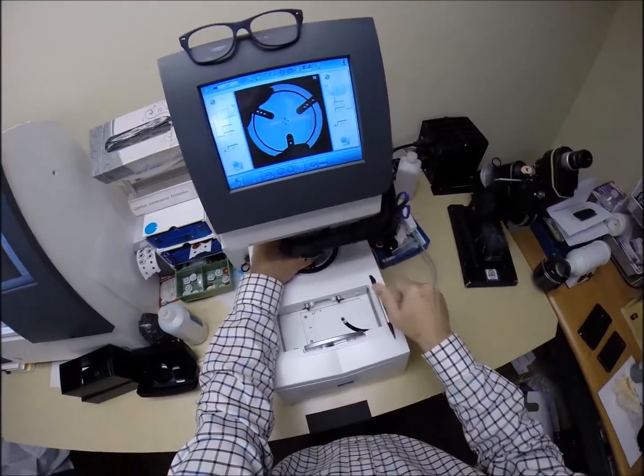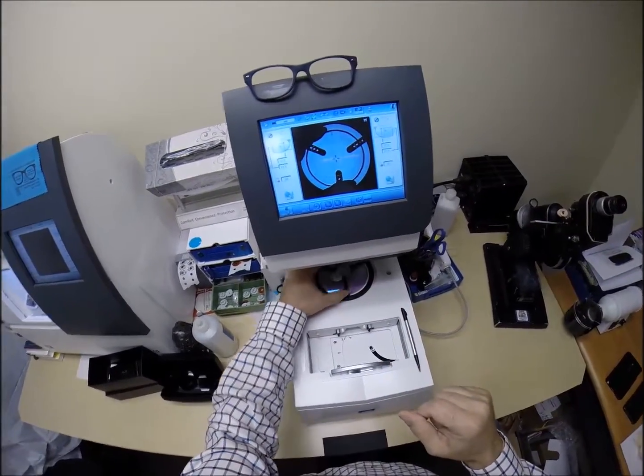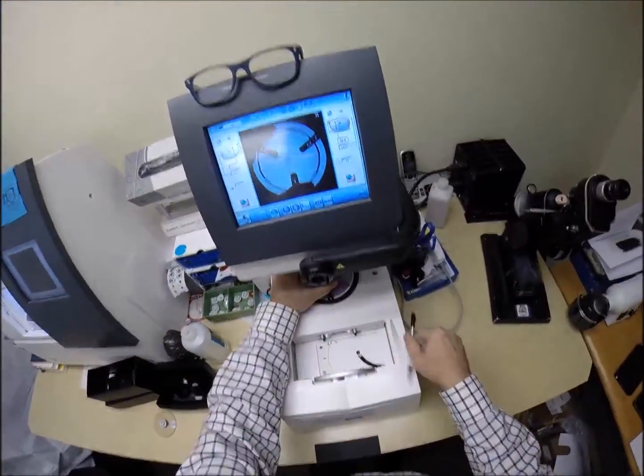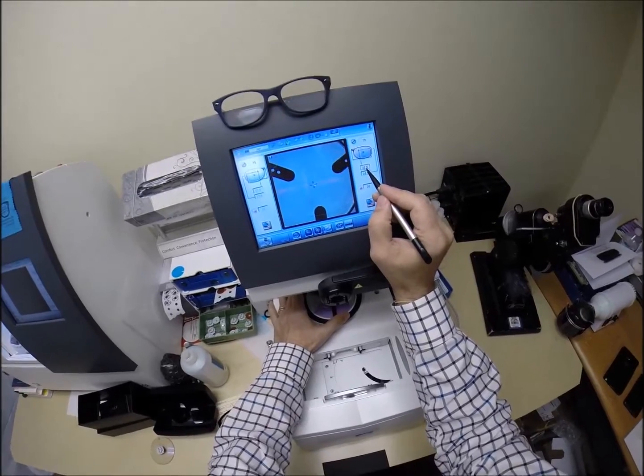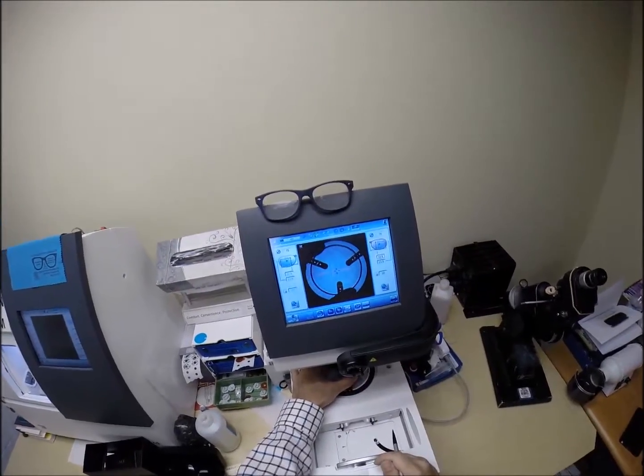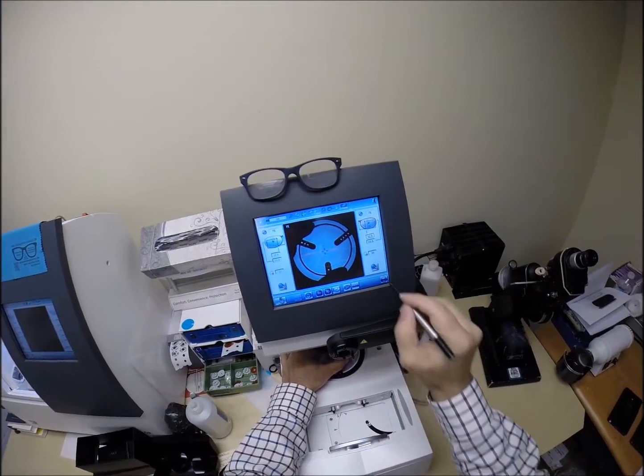Hit the button. Go back up with it. There we go. Now it's stuck on there. Let's do the same thing for the left. Now again, if these were prescription, I would enter the pupillary distance and the optical center height. I don't have to worry about that now. I just want to make sure that everything is large enough to fit.